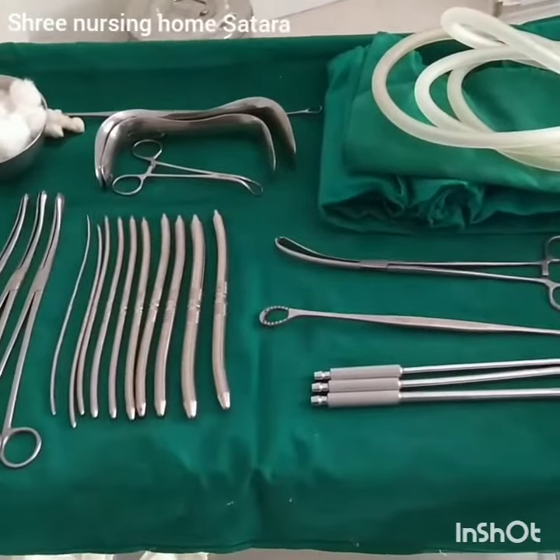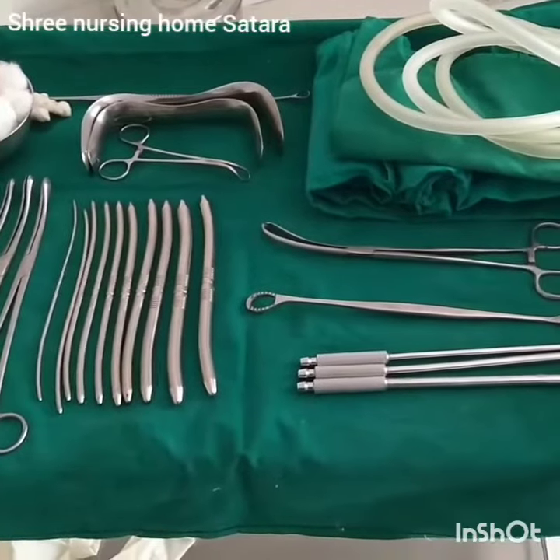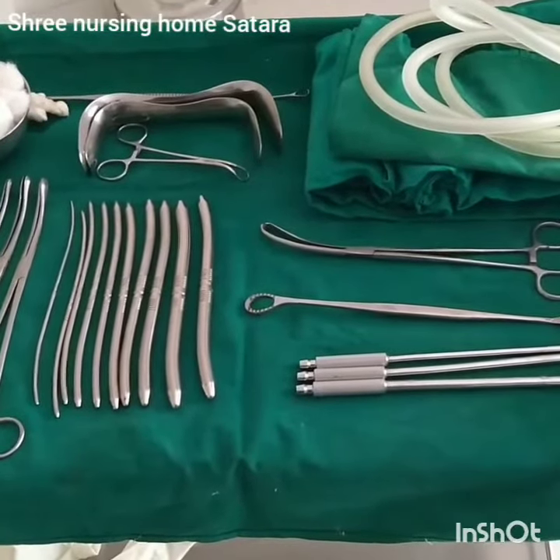Hello friends, I am Dr. Kiran Sonvalkar from Shri Nursing Home, Satara. Today's case is Dilatation and Curettage, means D&C, for incomplete abortion.